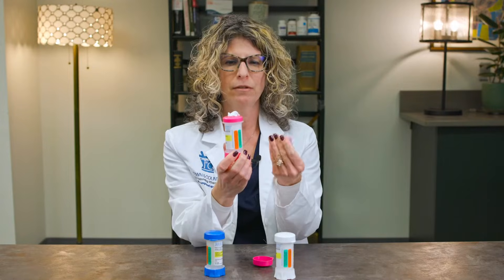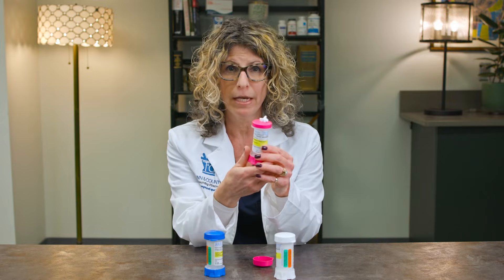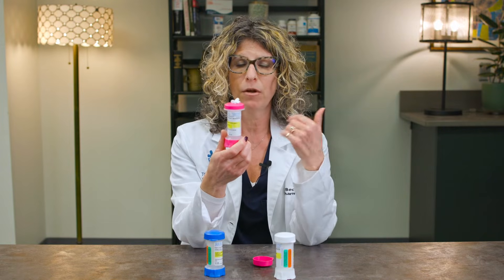Then you're going to apply the cream to the appropriate area. Most people apply it to a slightly fatty area on their body, which would be the insides of your thighs, the insides of your arms, or the tops of your buttocks — those are the most common.